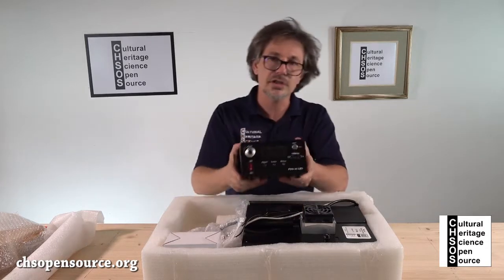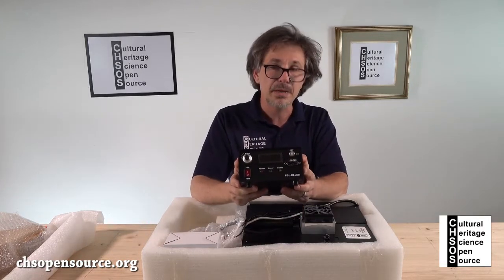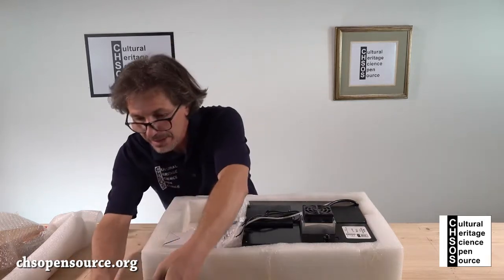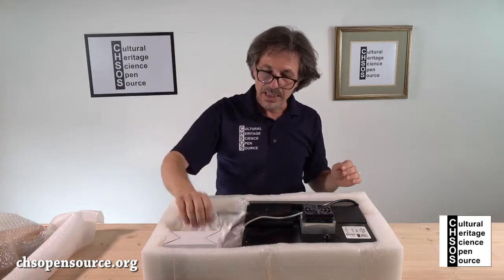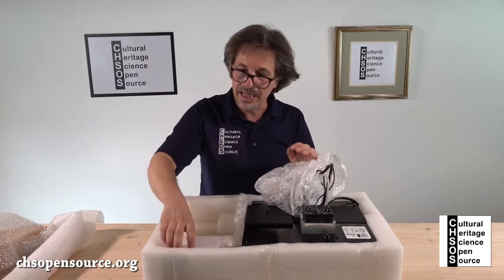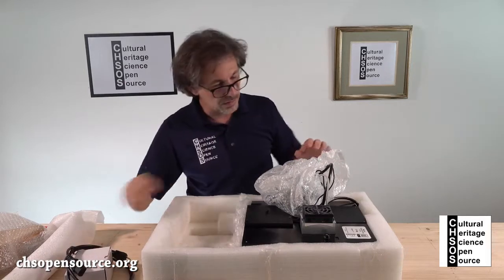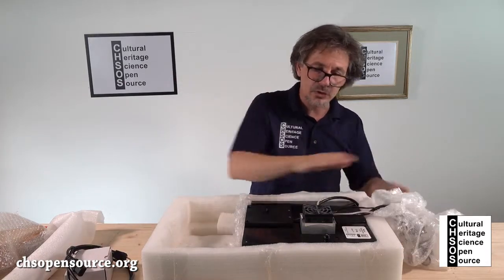This box is the power supply for the laser. Then here we have the cables — there is another cable. And this one is the actual spectrometer.